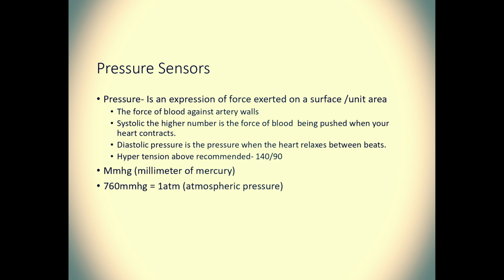On a human body, the force of blood against artery walls is what we are going to measure. The systolic is the higher number, and diastolic is the lower number. Everyone has seen these readings, systolic and diastolic.